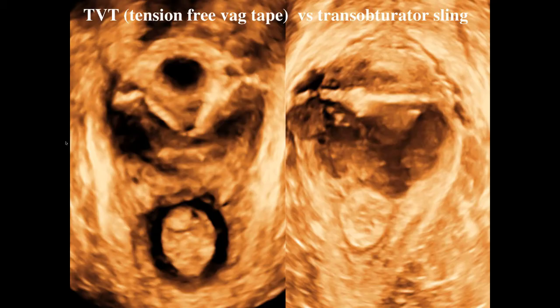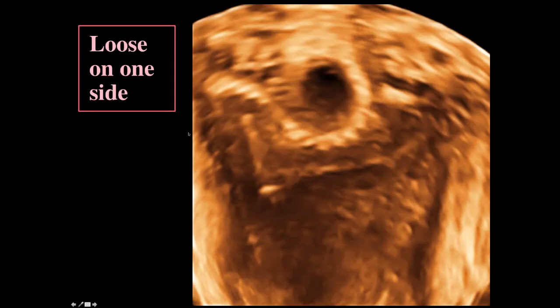And part of what we do with ultrasound is we can determine when they're not in the right place or fractured and when they're no longer working. So let's look at some examples. Here is one. There's a sling right here. This was a TVT, and you can see the urethra here, but one side has come loose. And so this side no longer is attached. It should have been attached over here, like this. But instead, it's got loose, and it's tied around the urethra. So this is obviously not going to work very well for this patient.